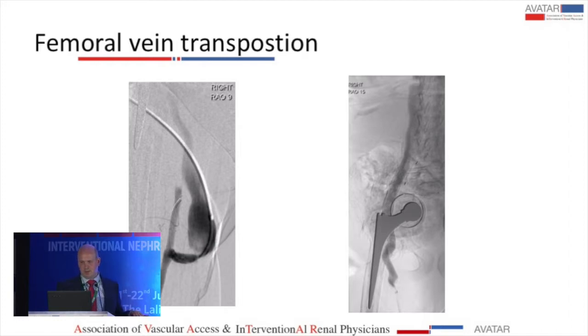It probably belongs on this slide, but here's more desperate measures. I've gone from the left common iliac artery right across the abdominal wall into the IVC for occluded iliac veins bilaterally. This is like your surgical lumbar line, I suppose. I've taken a leg loop off a bypass graft, which everyone said was insane because of the risk of infection, and got away with it, but that's one for one. Like I was saying, Tushar, never again. We'll just accept that.